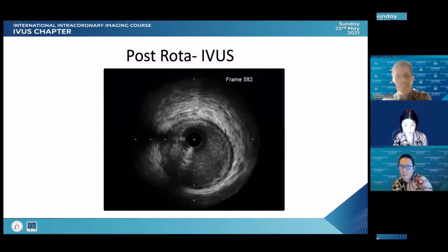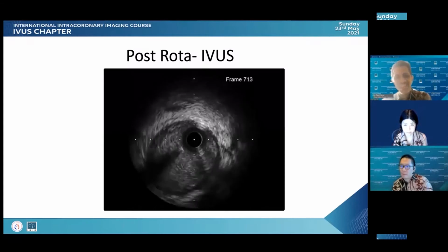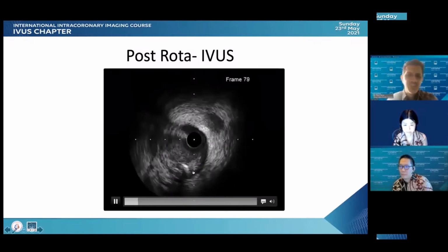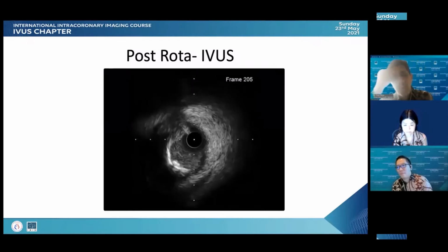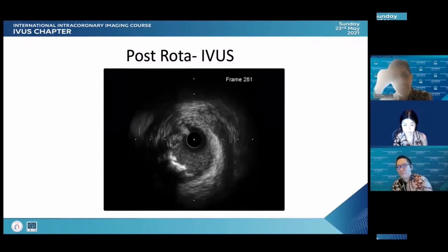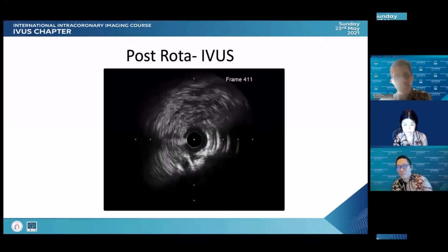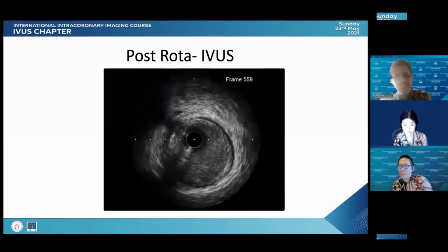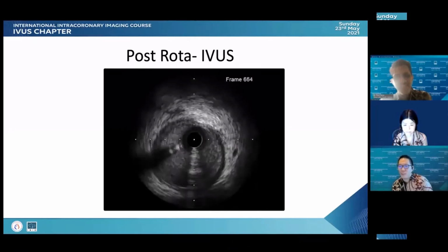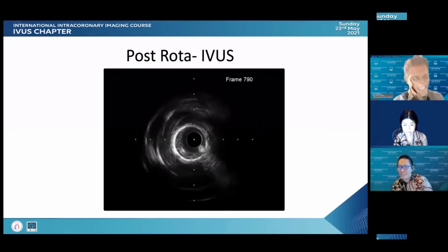I would agree with Prof. Akiko as well. I think it's important to see the fracture before we put the stent in. So what do you think, guys? Whether we have to proceed to stenting or do further predilatation? For me, do the predilatation first and protect the left main. So what you're doing, Dr. Fauzi, we are very excited to see.